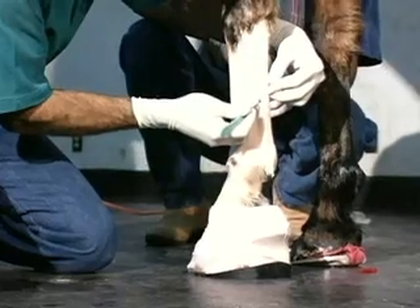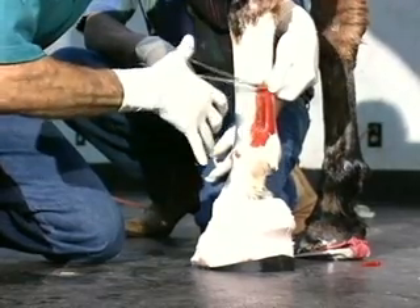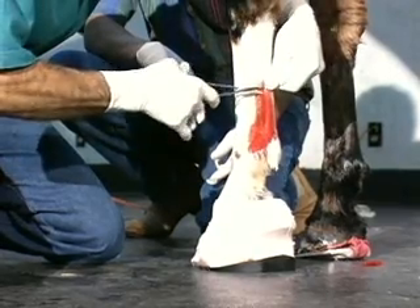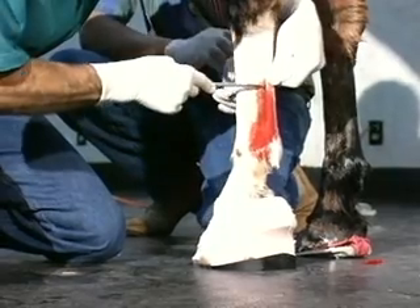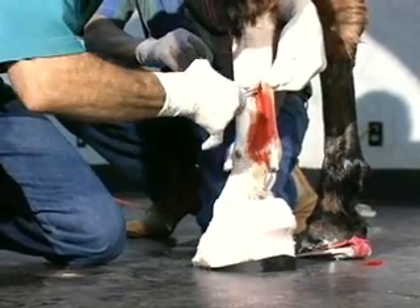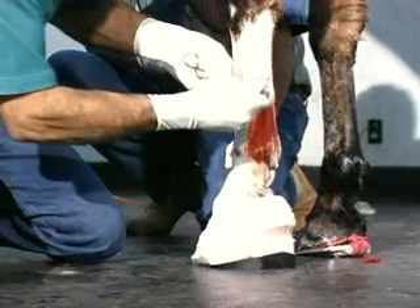You make the incision right along the junction of the superficial and the deep, usually right below the anastomotic branch. Use a pair of mosquito hemostats — go in to bluntly dissect between the superficial and deep. I'll also run them just on the interface of the deep. This pushes the nerve forward. I will actually leave my hemostats in place as I slide my first retractor in. It's very important to break up any adhesions that might be in this area — it makes the procedure go somewhat smoother.